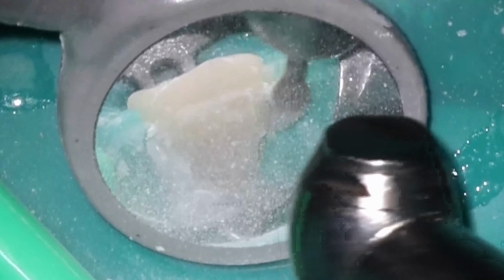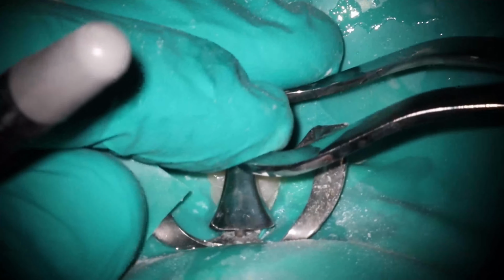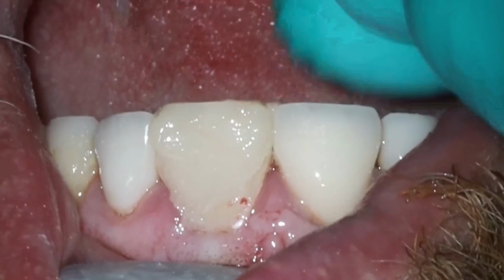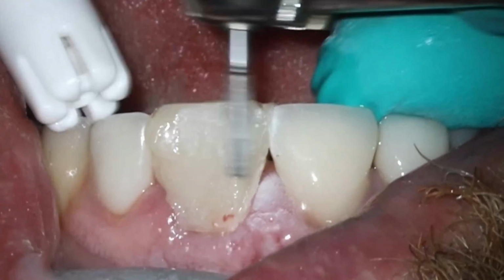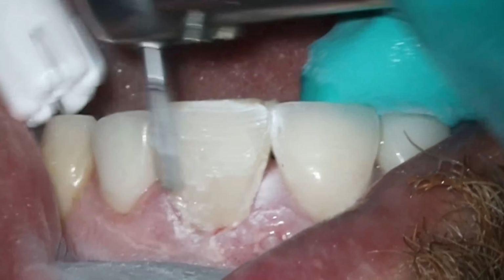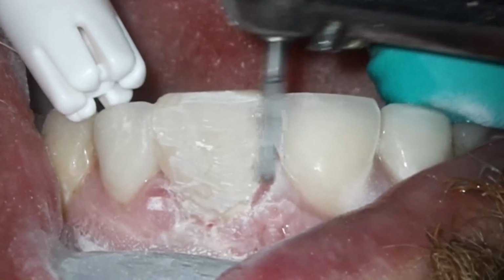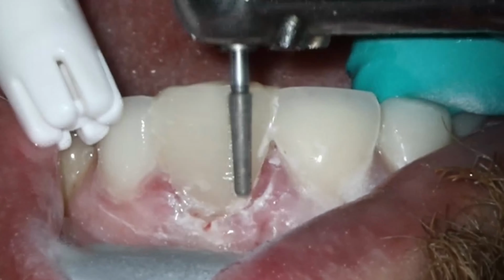Do as much of this as possible with rubber dam on, because there's no lips, there's no tongue. You don't have to worry about the patient. Sometimes when you do dry, they will cough a little bit because it does send up dust everywhere. But pop off that rubber dam, and here's what it looks like. So A3 actually is not too bad of a shade. I have found the Occlusal does darken over time a little bit, which is what we're going for here. But like I said, by the time this video comes out, he's already got the crown done.